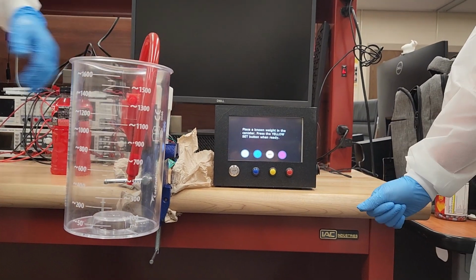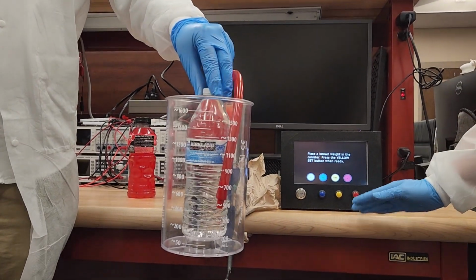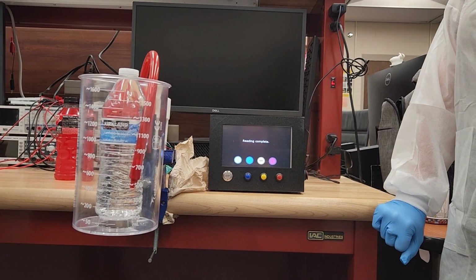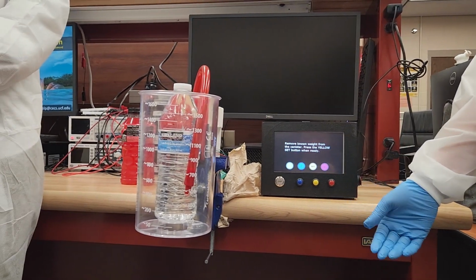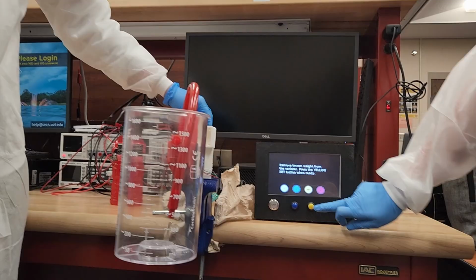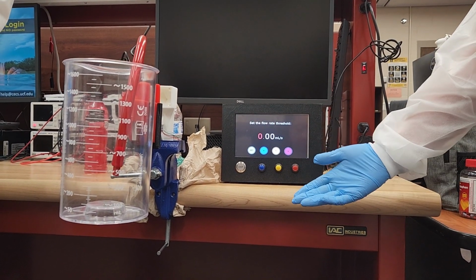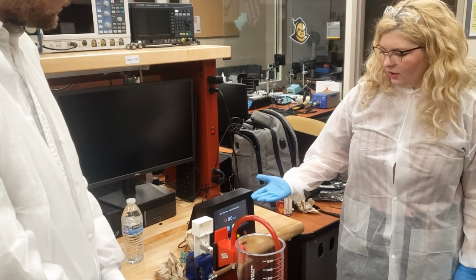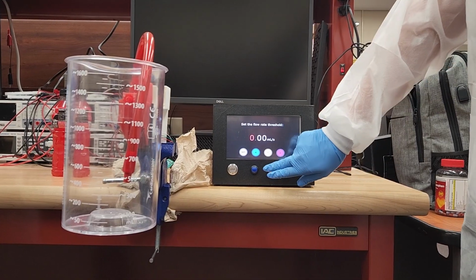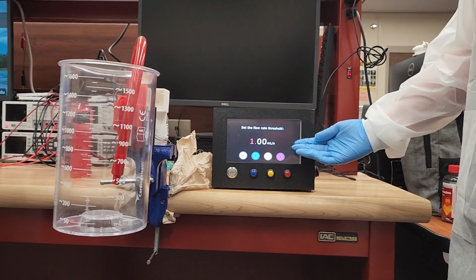The tare is complete. Now we will place a known weight into the canister, and I will press the yellow button when we are ready. The reading is complete. Now we can remove the known weight from the canister, and I will press the yellow button since we are ready. The removal is complete, and now we can set the flow rate that we wish the alarm to go off, and I will set that to 1 milliliter per second.